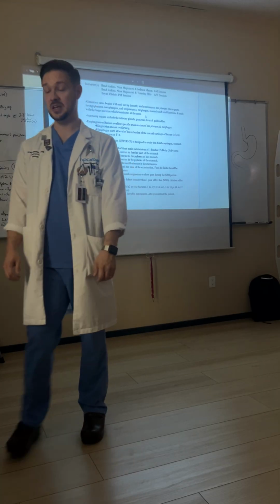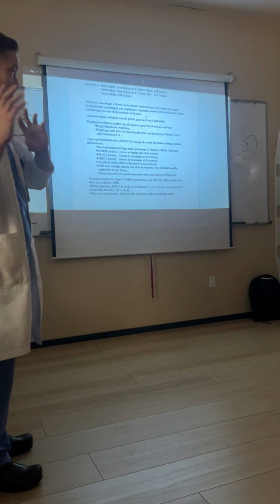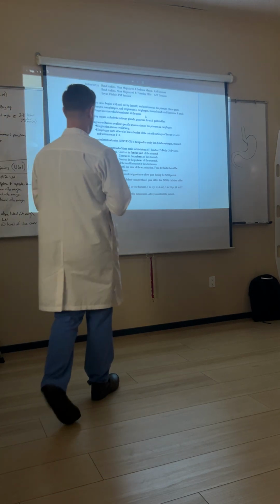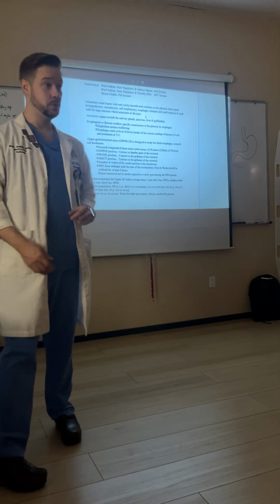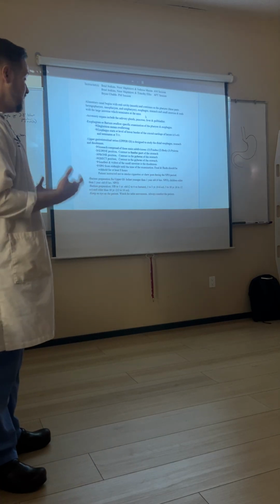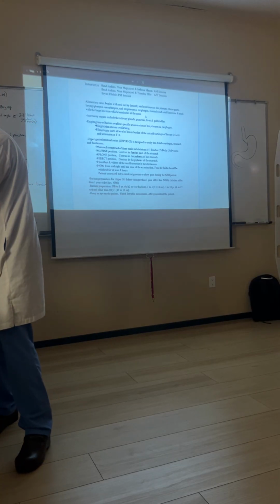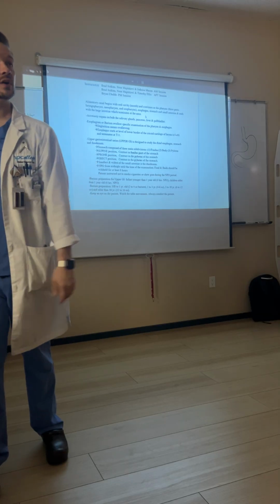For fluoroscopic exams, it doesn't matter what it is, I want you to take this rule forward for every exam ever. Actually, even radiographic exams, we've already said this before. Keep an eye on your patient. Most important for a fluoroscopic exam, the radiologist is going to come in and pull the fluoro tower over, and they're going to be doing the exam, looking at the screen. They're never going to look at the patient.